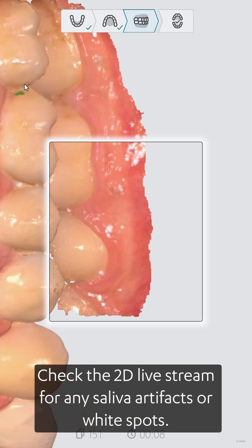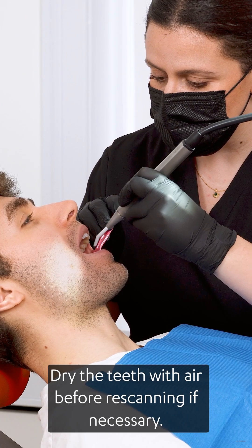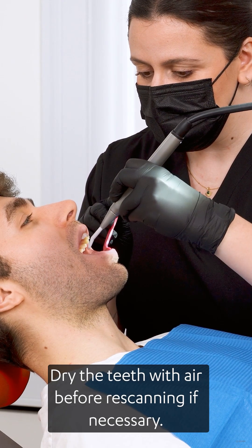Check the 2D livestream for any saliva artefacts or white spots. Dry the teeth with air before re-scanning if necessary.